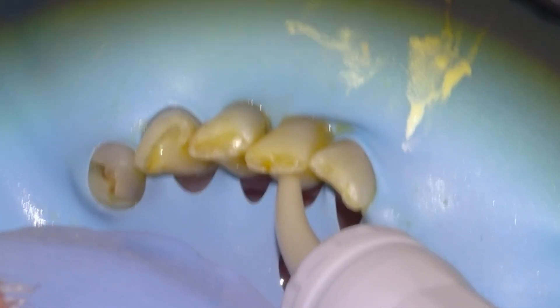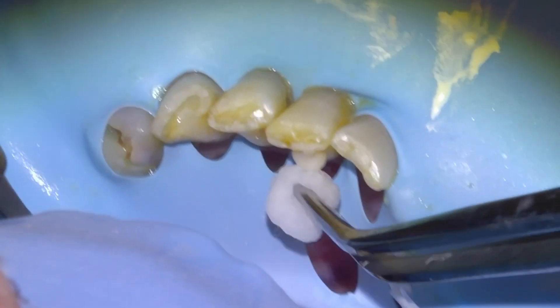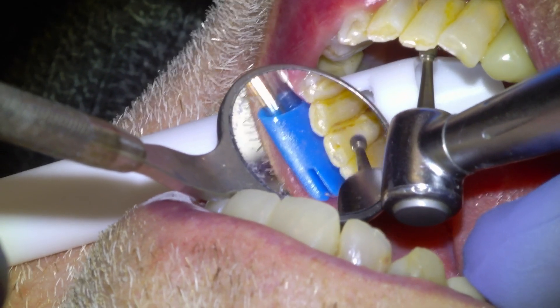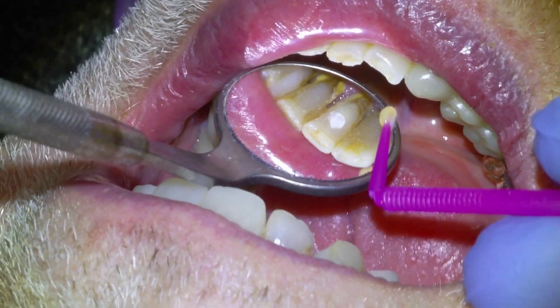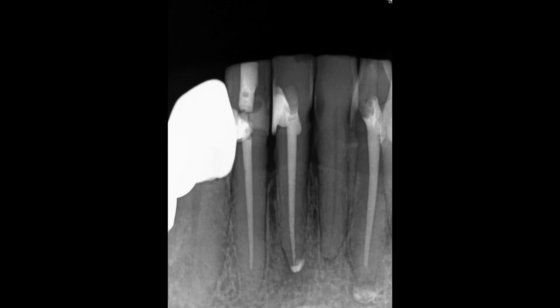Overfill, pack it a little bit with the cotton pellet, then wait five minutes, come back, remove the excess, varnish it with Equia Coat. Obviously this tooth is due for a cleaning and some other work, but it was painful and the patient didn't want to take it out, so endo was the best option. And that's that.